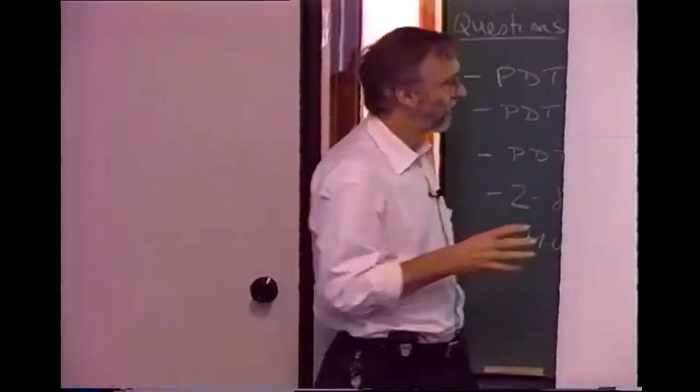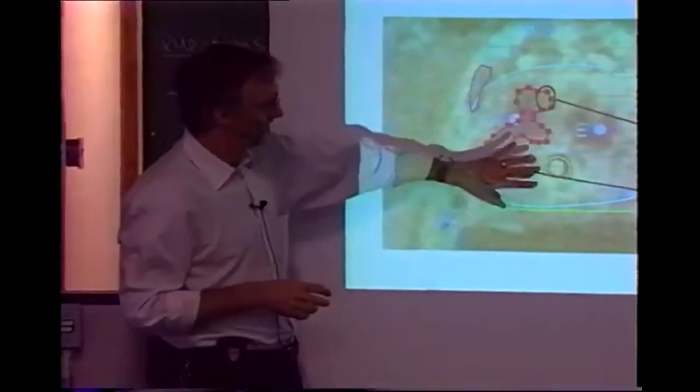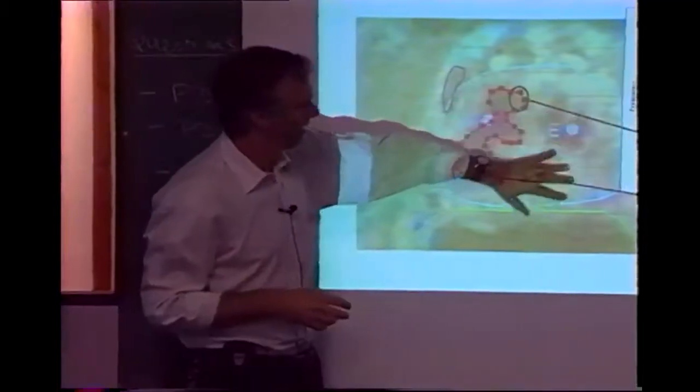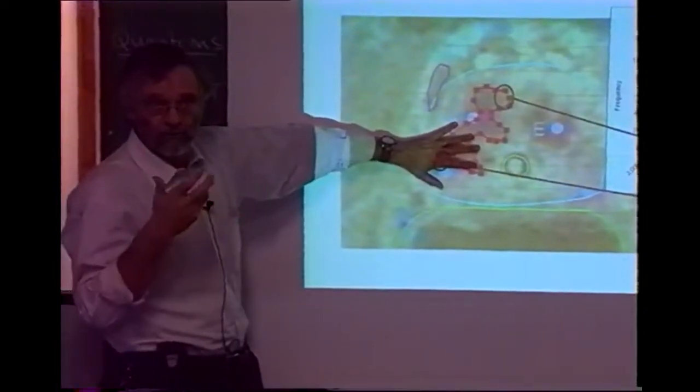It's perhaps the most challenging area for PDT because you want to treat the whole of the prostate for cure.